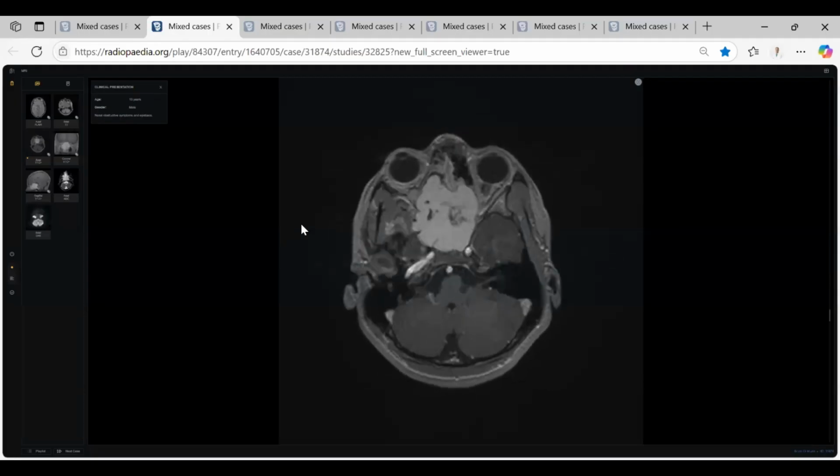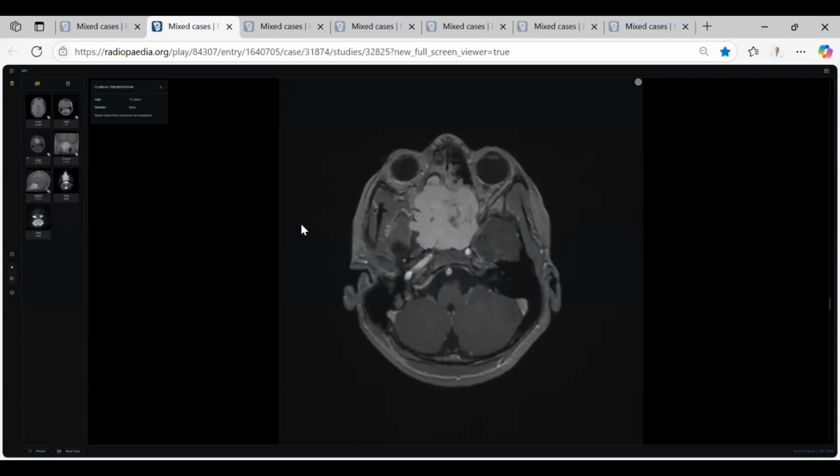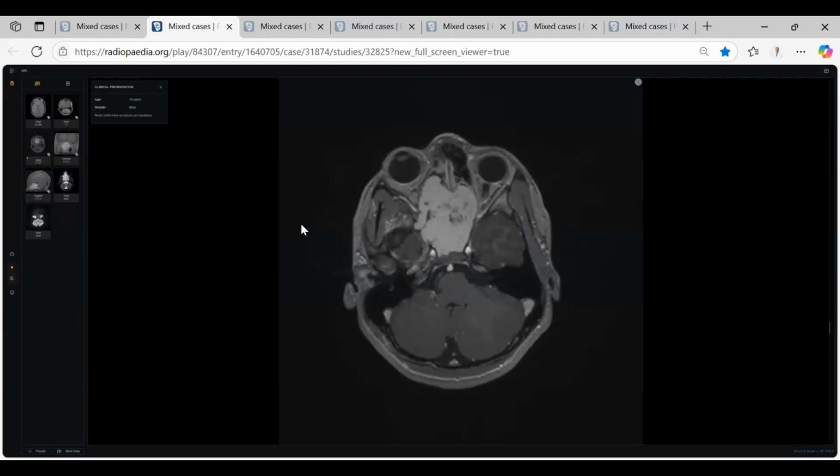As the lesion is intensely enhancing and causing epistaxis in a teenager, I will think about angiofibroma. Okay, so you are describing a benign but nasopharyngeal tumor. Yes. See, you are describing a nasopharyngeal benign tumor. From the beginning, you must put yourself on the correct track. I'm describing a benign tumor in the nasopharynx, especially highly vascular because it is a young age. This is very important.